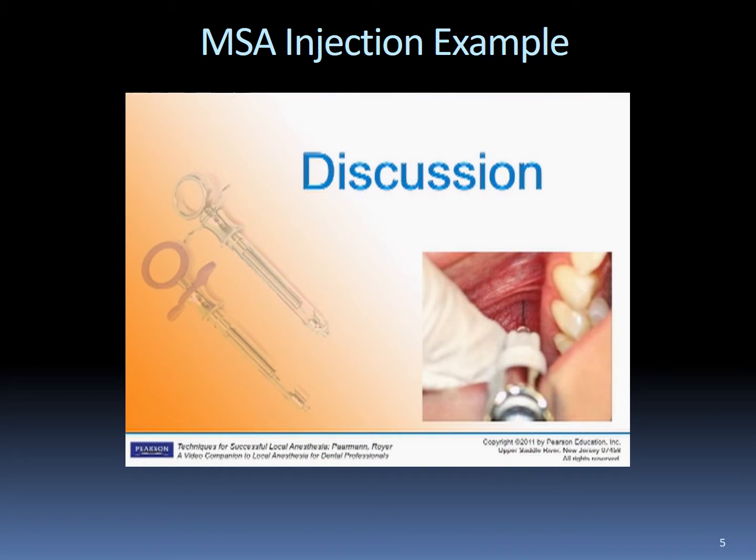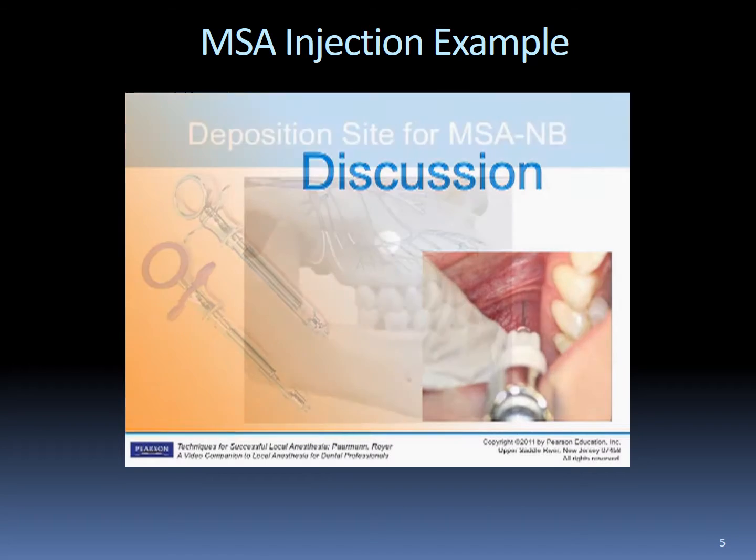Potential complications from this injection are minimal. There is the possibility of discomfort if periosteum is contacted. Be sure to stay parallel with the long axis of the tooth to avoid such touching of the periosteum. Ballooning of tissue may occur in this region. Also, it is possible to see some hemorrhage at the site of penetration.